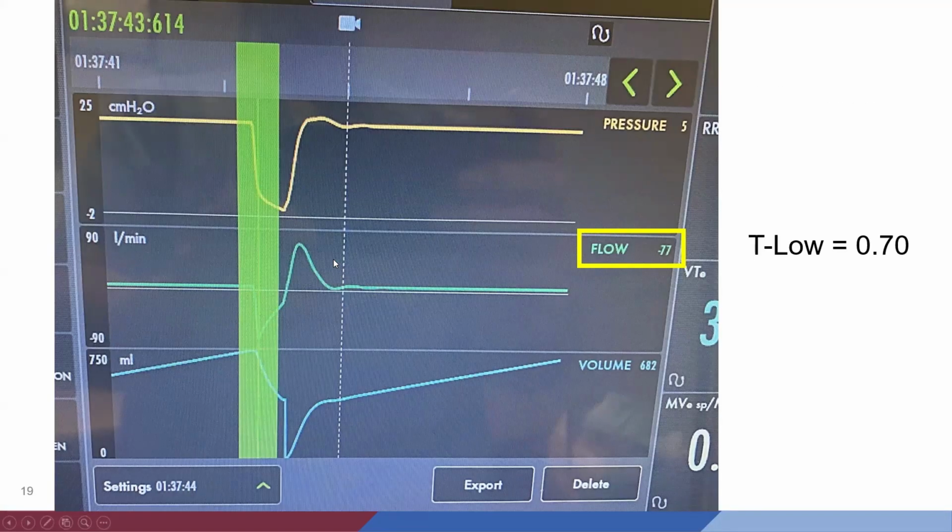When you go back, I had a screenshot of it here. Did I go too big? No, I didn't. Anyway, put the cursor right here on this point. And you're looking for the largest negative number right on that point.